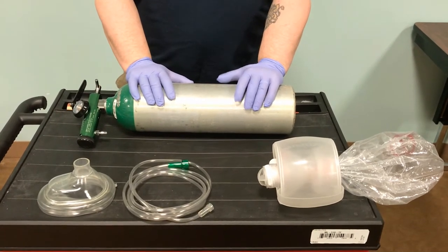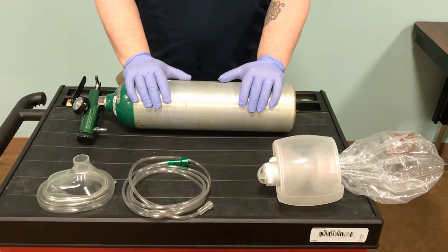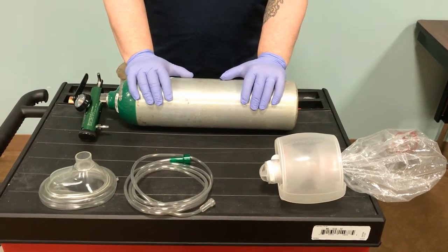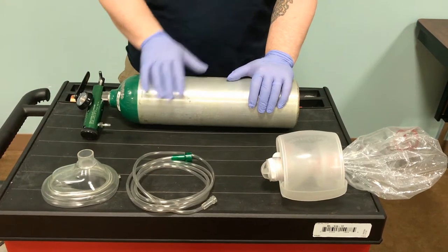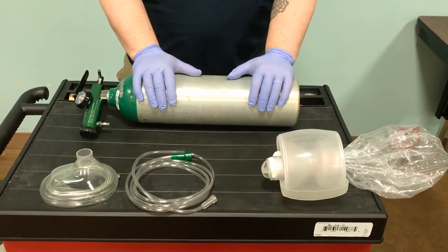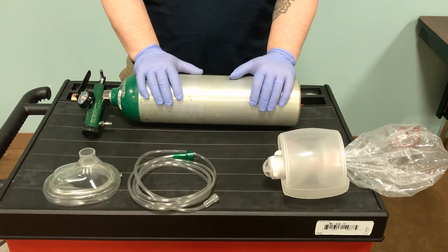So now we need to intervene and we're going to use our BVM. I'm going to show you how to assemble the BVM and then show you how it delivers oxygen. Part of your CPR testing is showing that you know how to assemble this and get it to deliver oxygen, and then we'll show you how to use this to actually ventilate the patient.